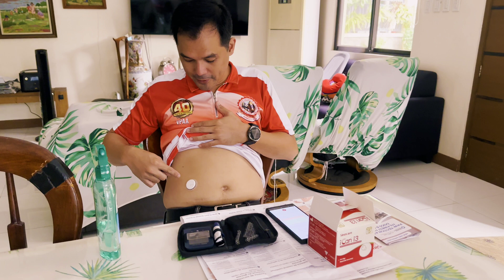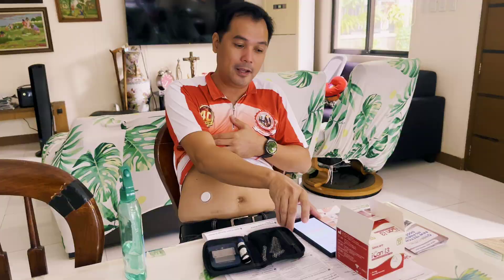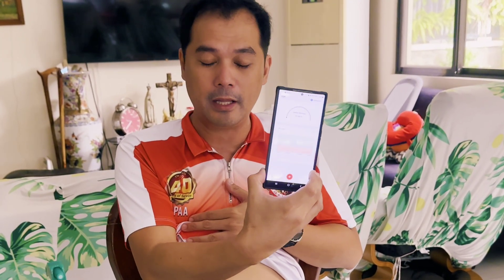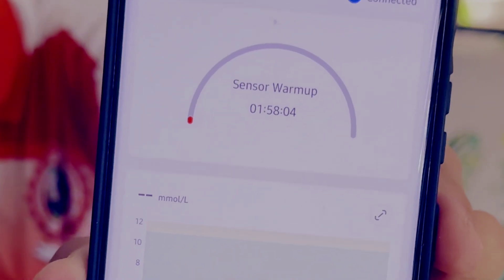Okay guys, I already installed the sensor on my tummy — it's very easy. There's a very user-friendly tutorial on the app on how to install it. So now the sensor is warming up; I won't be able to measure immediately. The warm-up takes about two hours.